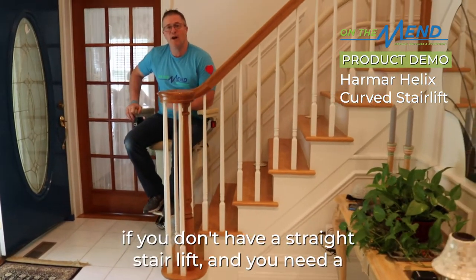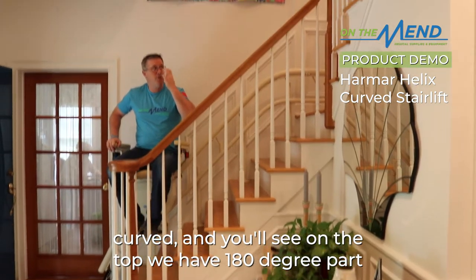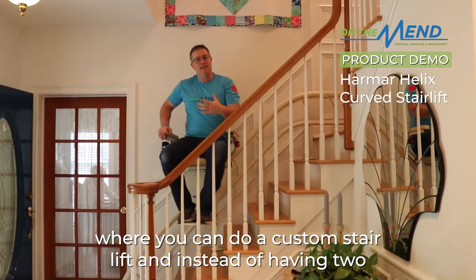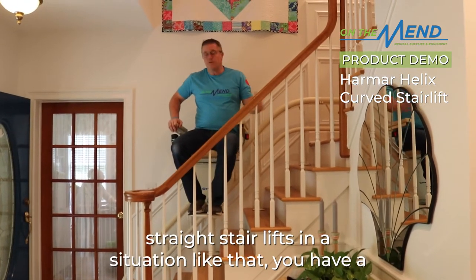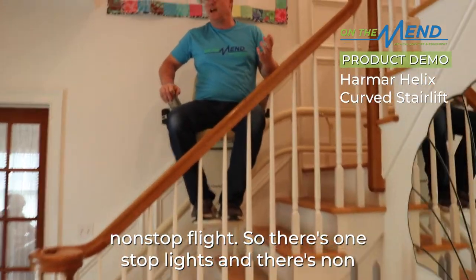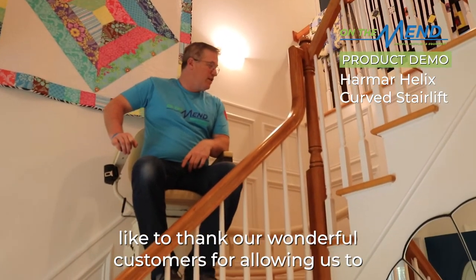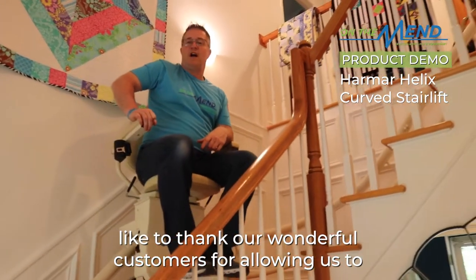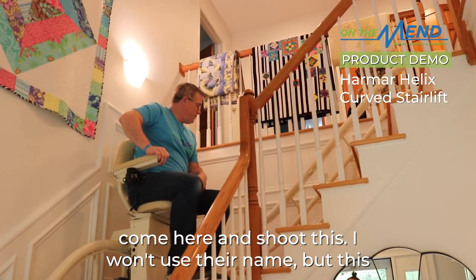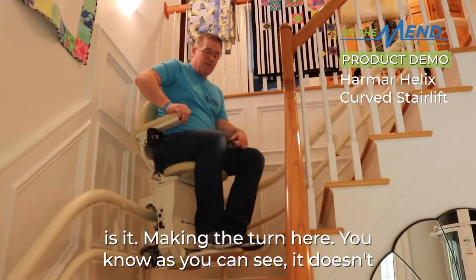If you don't have a straight staircase and you need a curved stair lift, you'll see at the top we have a 180-degree section. Instead of having two straight stair lifts in that situation, you get a non-stop flight. There are one-stop flights and there are non-stops — this is the non-stop flight. We're going up, and we'd like to thank our wonderful customers for allowing us to come here and shoot this.